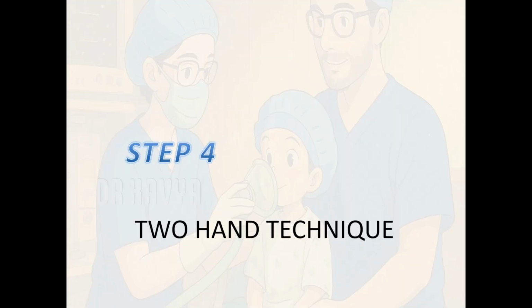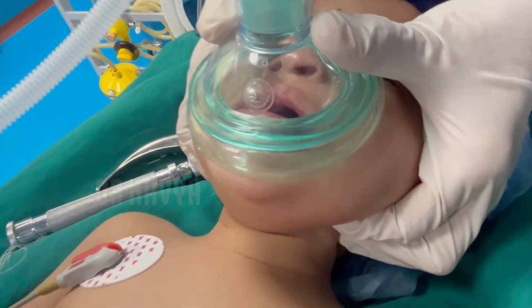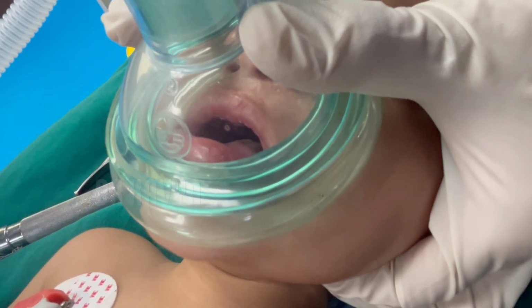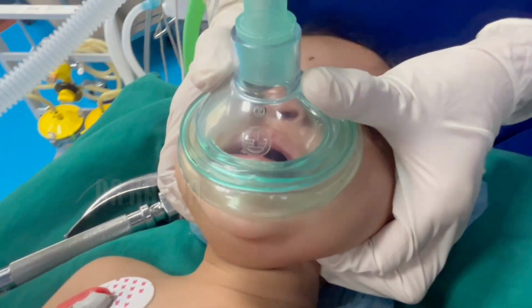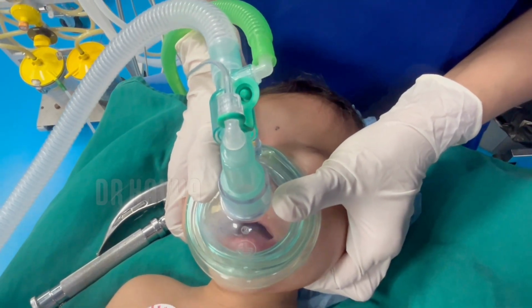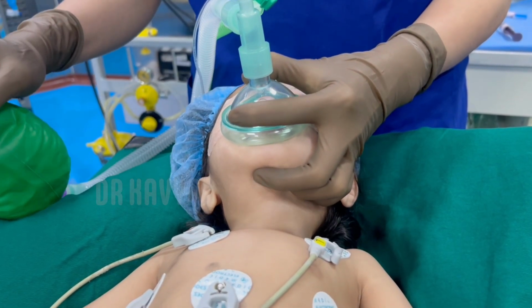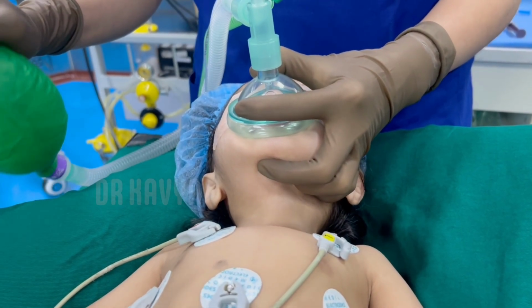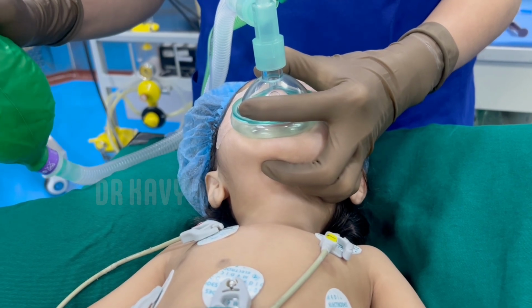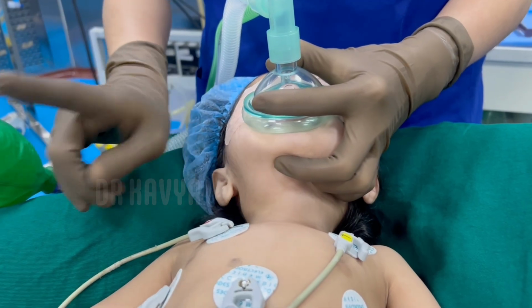Step 4. The two-hand technique achieves better ventilation than the one-hand mask ventilation technique. Here, the operator uses both hands to achieve seal while maintaining airway patency by jaw thrust, and an assistant provides the ventilation. Ensure that soft tissue is not compressed during ventilation and fingers are only on the bony margins of the mandible so as to avoid obstructing the airway.